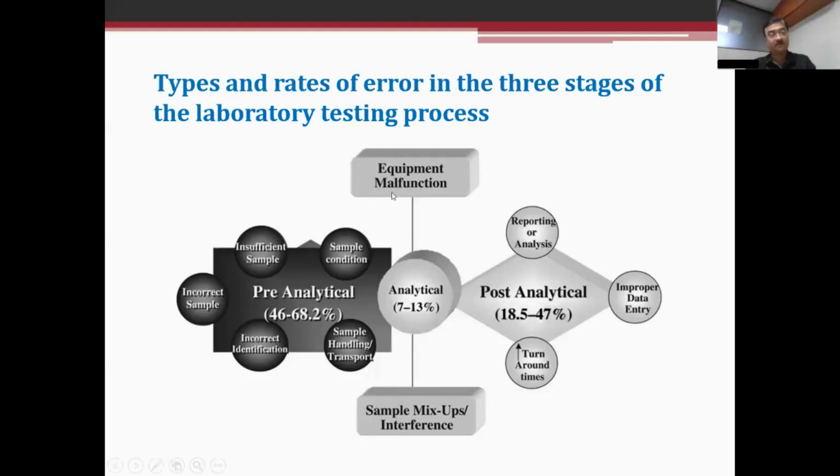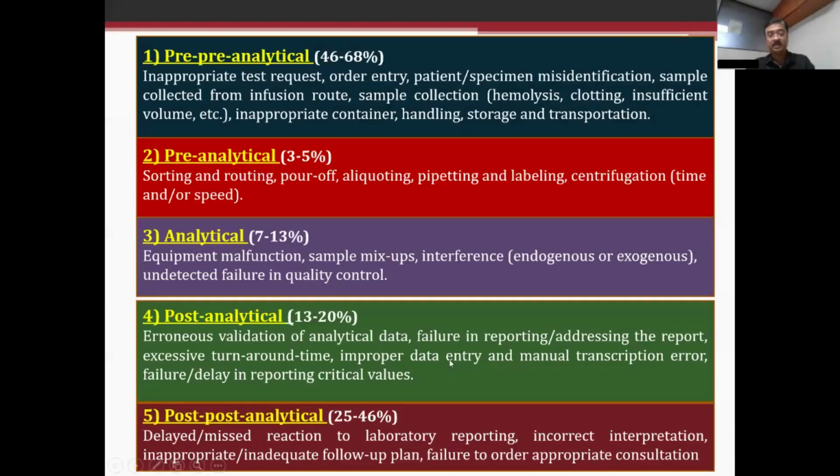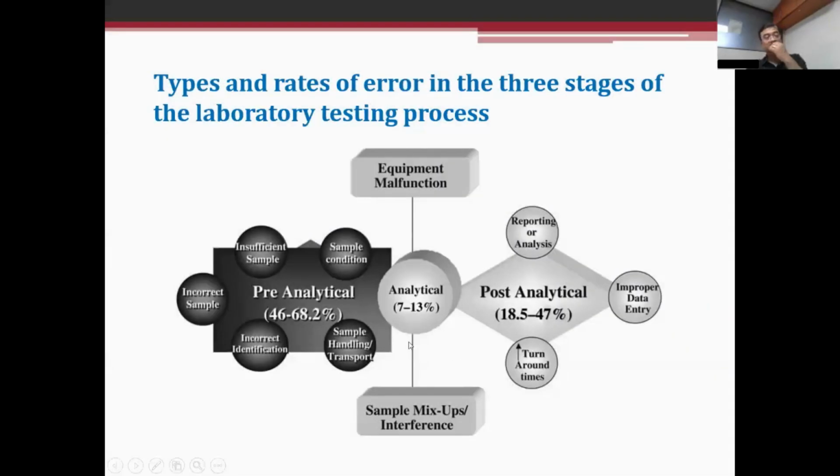Then equipment malfunction can be a reason, or even sample mix-ups can be another reason. So these are all analytical. But post-analytical: reporting or analysis of sample error, improper data entry, which is very common, and increased turnaround time, which is another condition I am coming to later on. They are all accountable for post-analytical error.